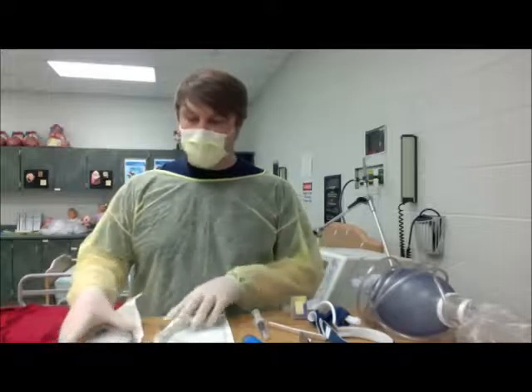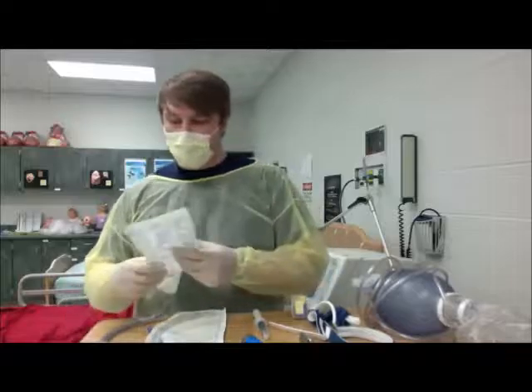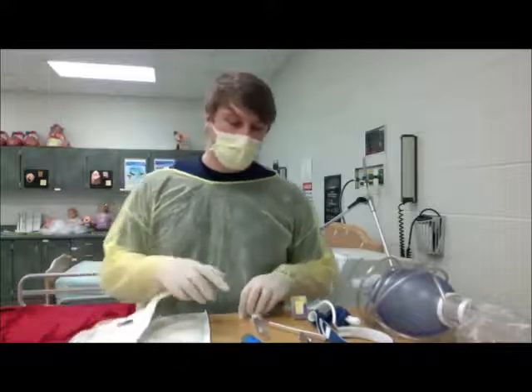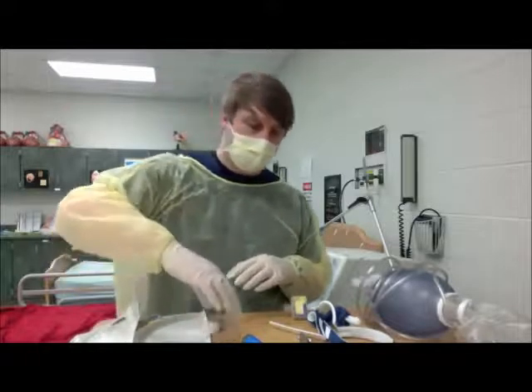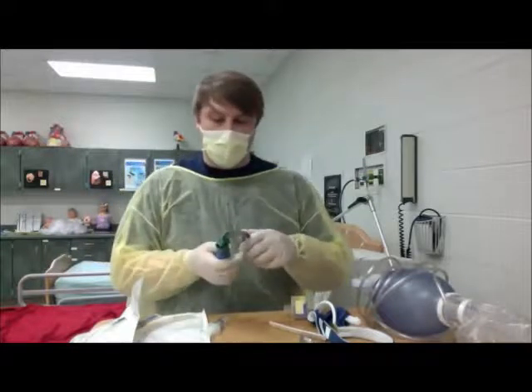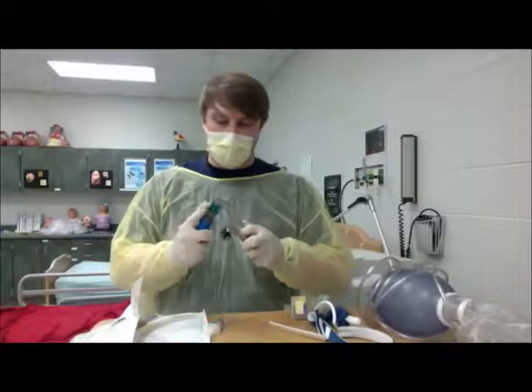With my intubation equipment, we have ET tubes. We got 1 above, 1 below. We have a syringe to inflate the bulb. We have a laryngoscope with a Mac and a Miller. I want to make sure the light works, and it does. Good.